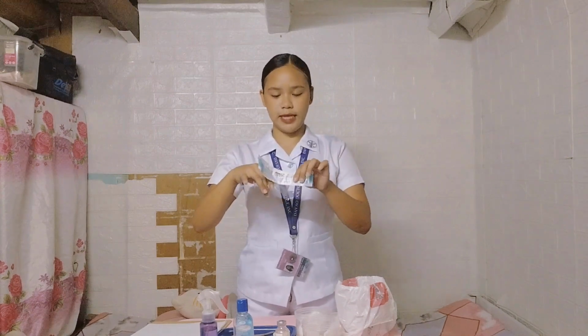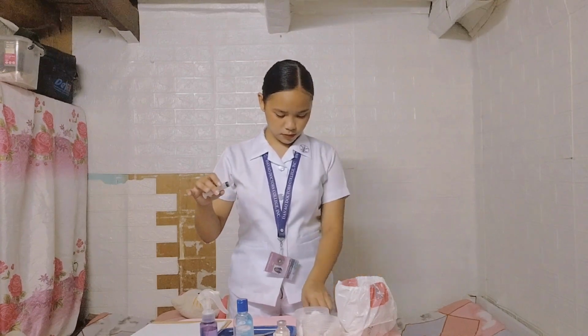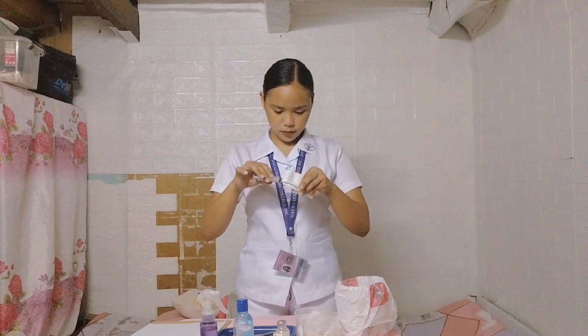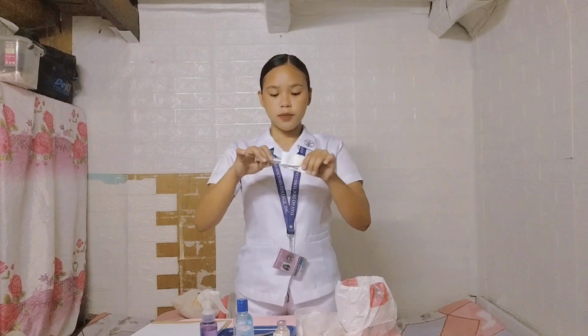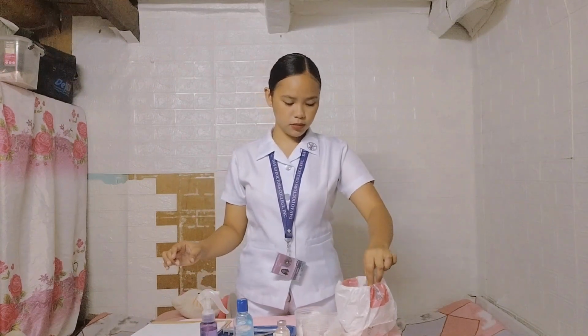If the syringe already has a needle, then loosen it to connect the aspirating needle. Make sure that the needle is firmly attached to the syringe. Then discard. And now let's get the ampule. Assuming that this is the ampule, and let's assume that I already did the steps, now let's proceed to withdrawing the medication.